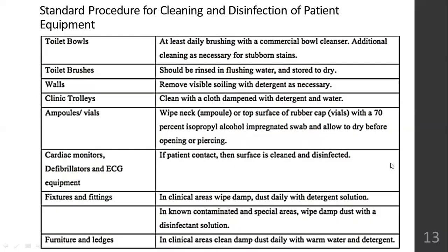Walls, whatever removable visible soiling is there, you can remove it, scrape it if possible. If it is tiled walls, then with detergent water you can mop it. Trolleys as well, wet mop with detergent water or 1% sodium hypochlorite solution. Any one option can be done.